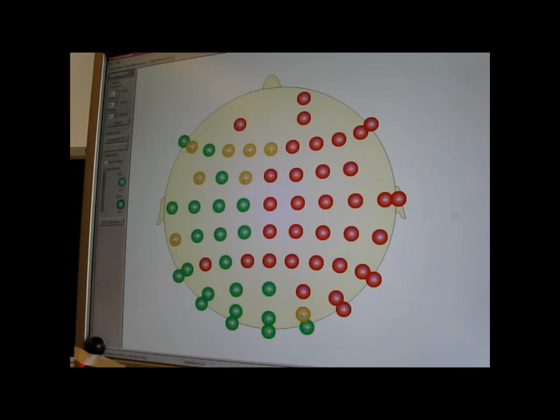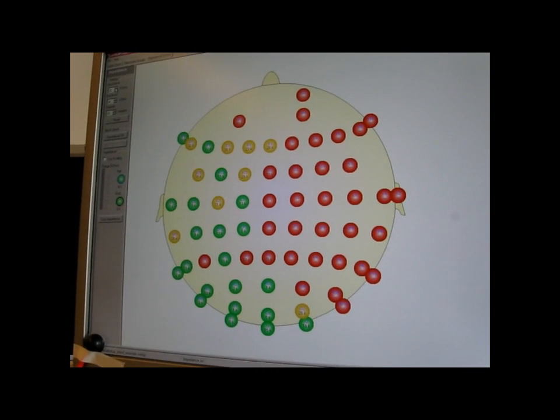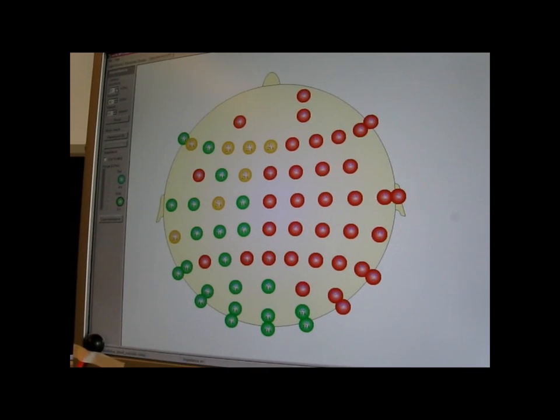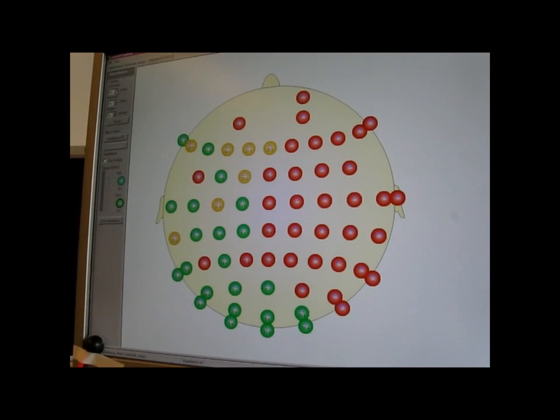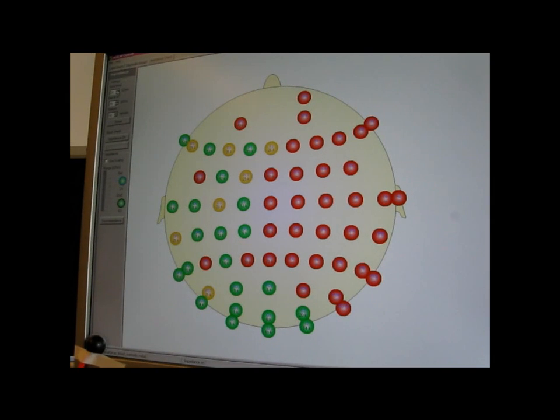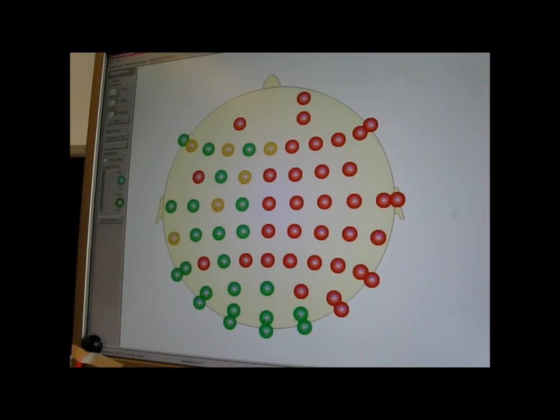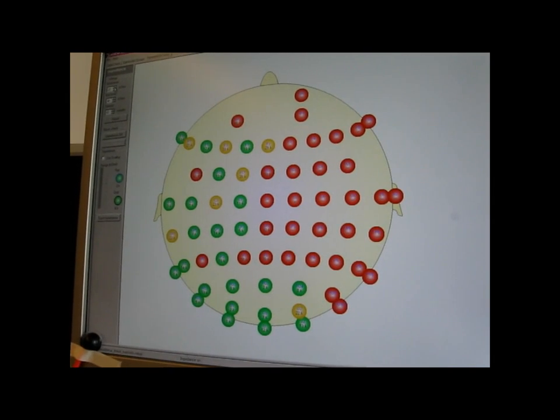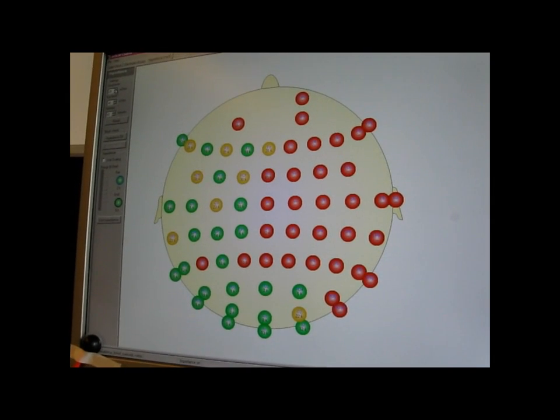And now for something completely different. What you can see here on the screen is electrode impedance from an EEG cap that I am wearing on my head.